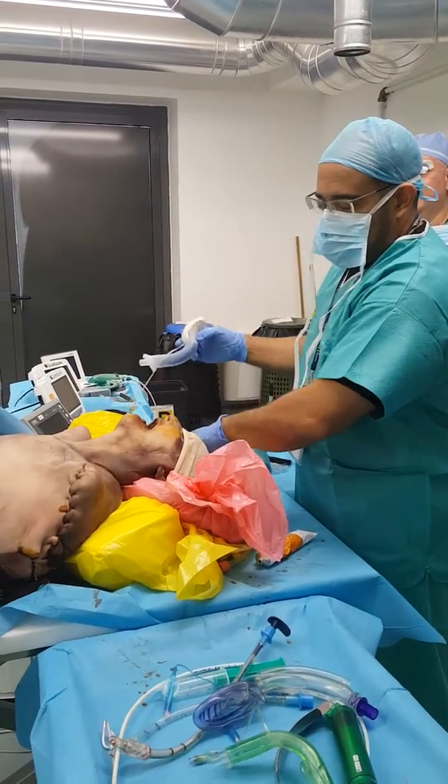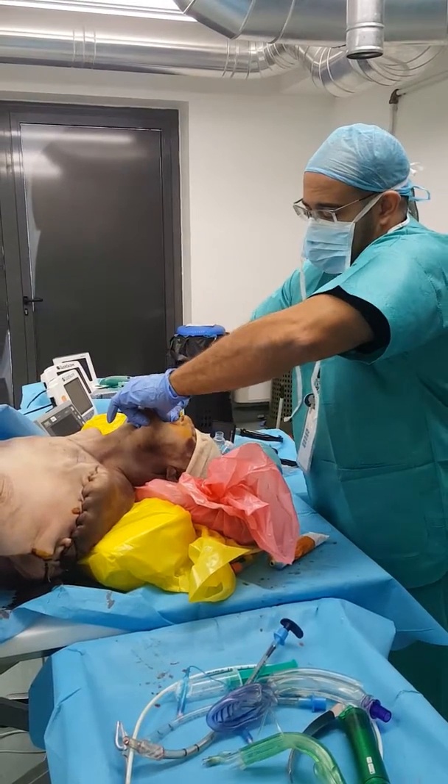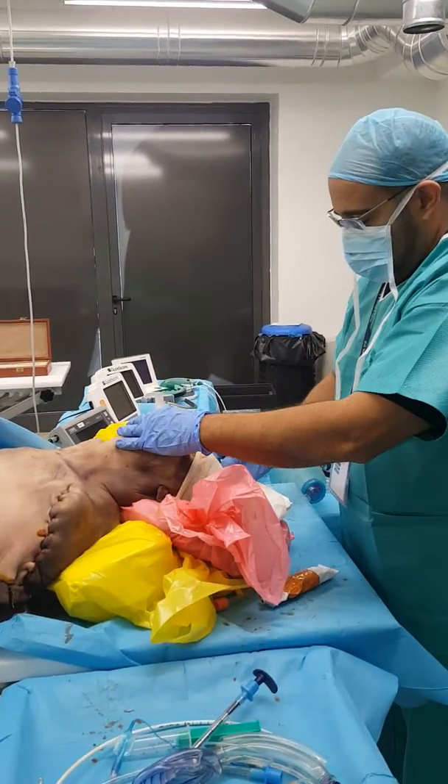One tighter. Let's go see if it works with this. You can see if it works. Thank you.